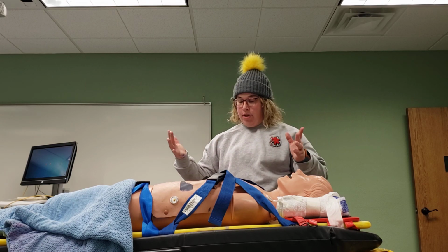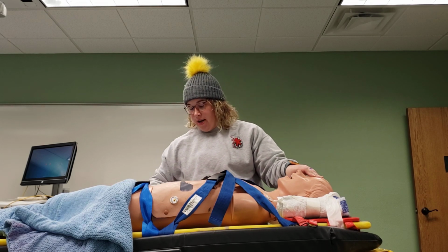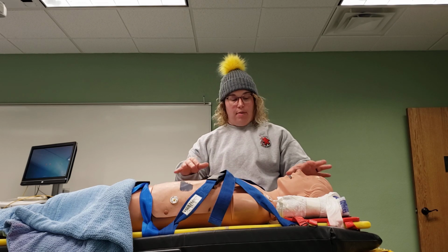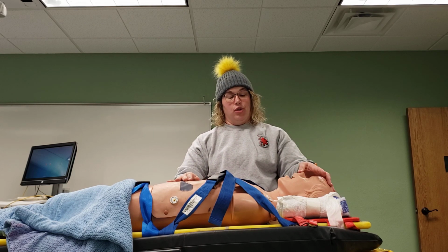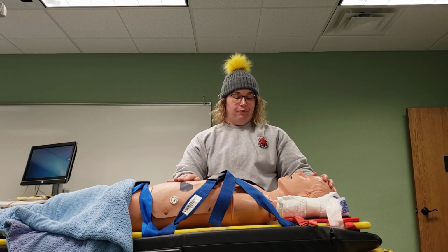And then the biggest thing with any airway adjuncts, again, is you could just do the straight in with the OPAs or with the NPAs, making sure you lube it up is the most common mistake that people make before they insert it. So that would be it.